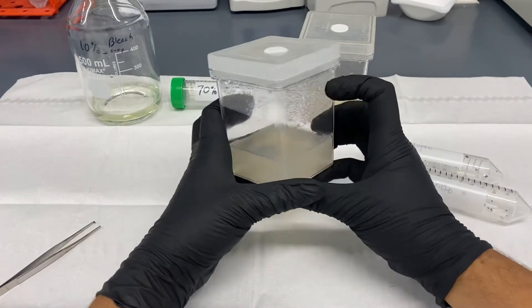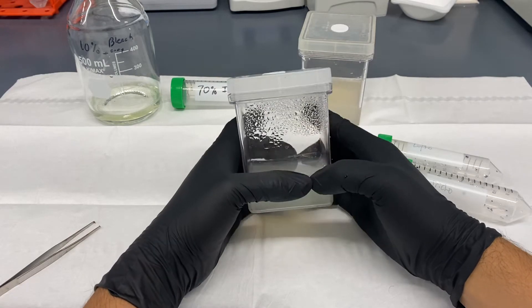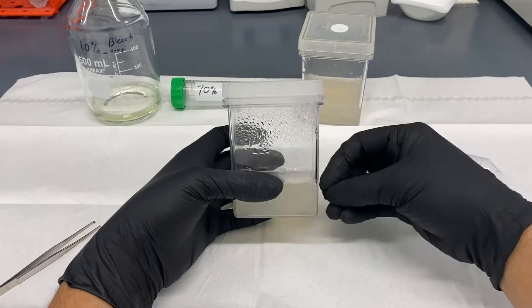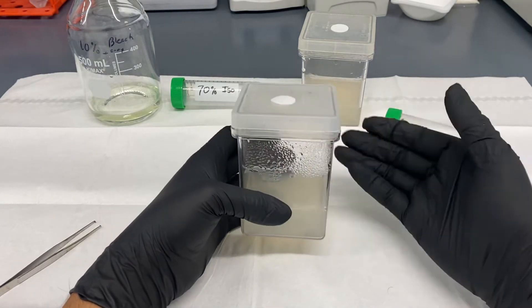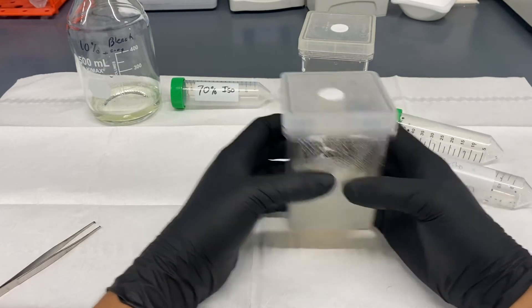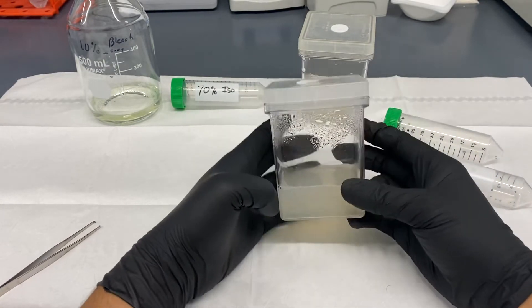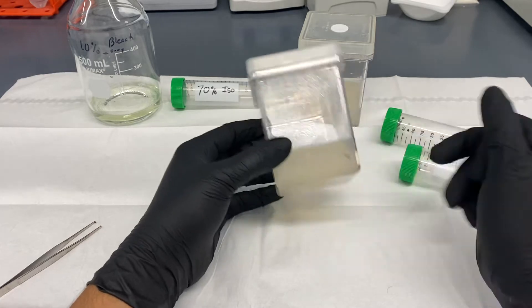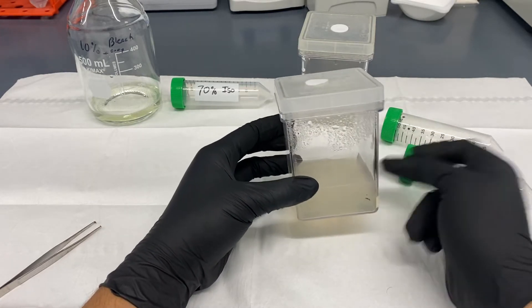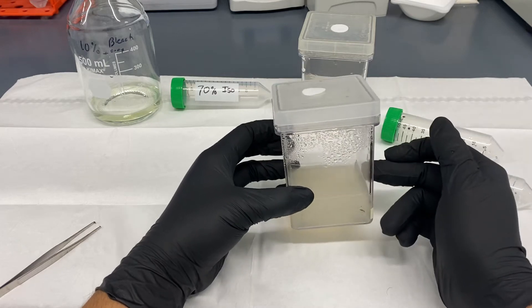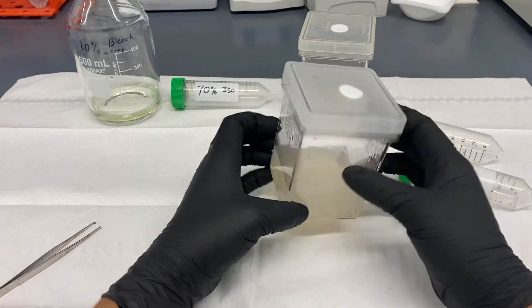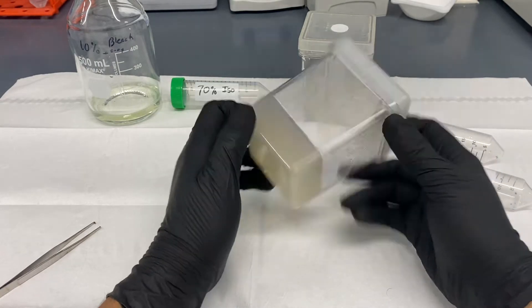Pretty much all you need to know with this gel is it has osmolarity for plant cells which means that the plants will not explode as if you were to put them on direct water, or on a high salt medium it could cause some osmosis and the cells to break. So this gel right here is agar, MS salts, water, vitamins, and a plant hormone. That's usually the essentials to making this gel solution.